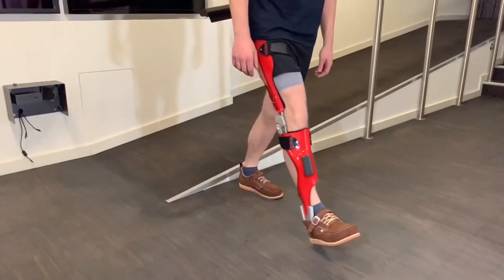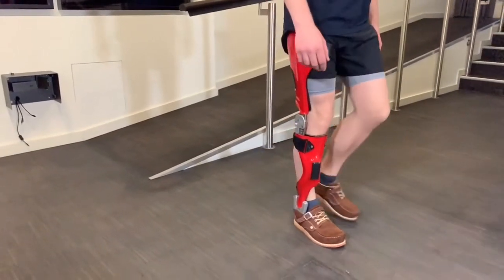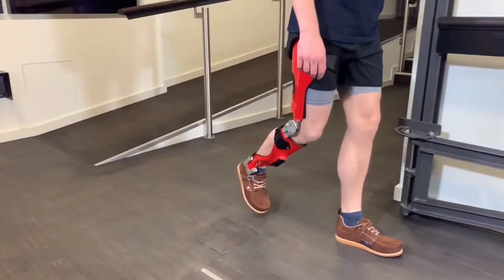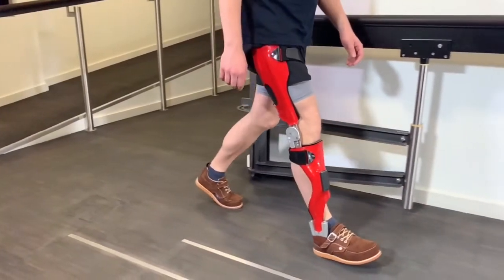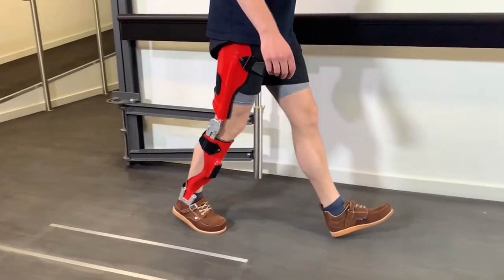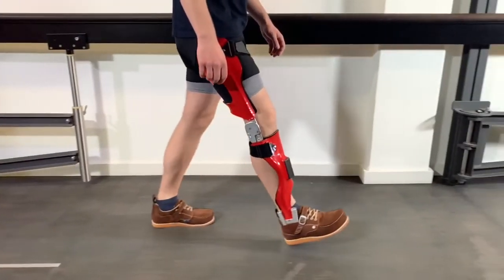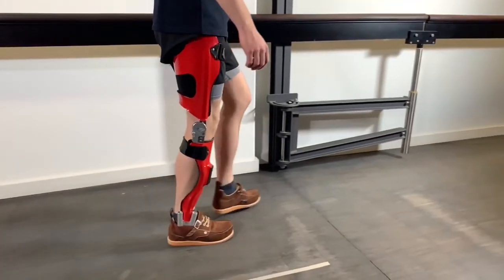Let's repeat this once again: initial contact, loading response, late mid-stance — now the joint opens to initiate the swing phase — and in terminal swing, the joint locks before the next initial contact. Regardless of walking speed and step length, the Neurotronic knee joint will register the end of the swing phase when the forward acceleration of the lower leg decreases.